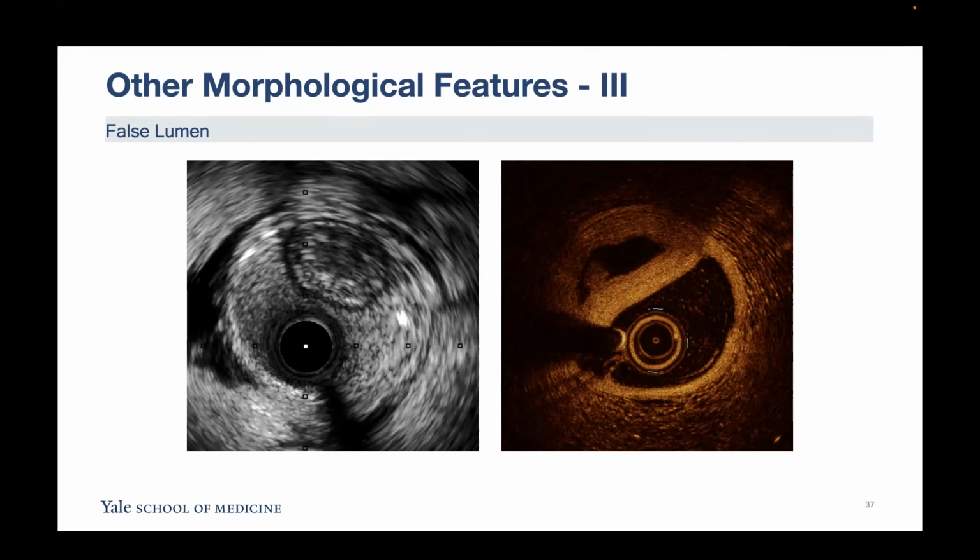So at the catheter tip there is a significant rise in pressure as opposed to the patient's average pressure. Once you get inside the vessel, there's no significant change in pressure. So I would say that from a mechanical standpoint, it's kind of safer to inject. And actually, we use OCT to diagnose dissections and so on.